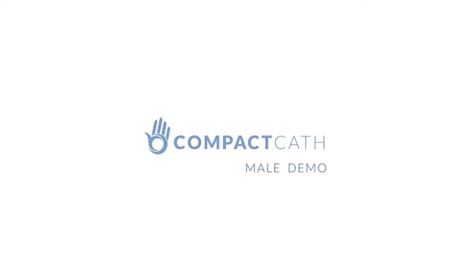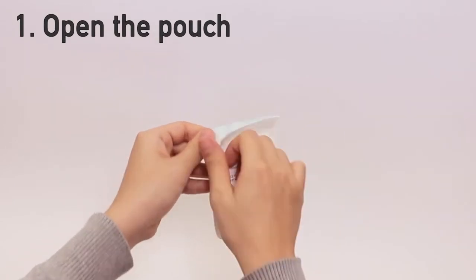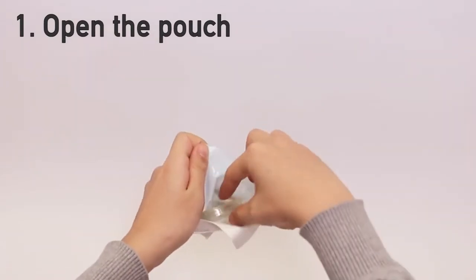This short video will teach you how to use CompactCath. Open the pouch by peeling back the blue layer from the white and take the catheter out of the pouch.